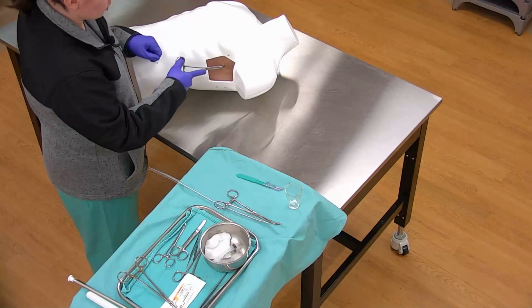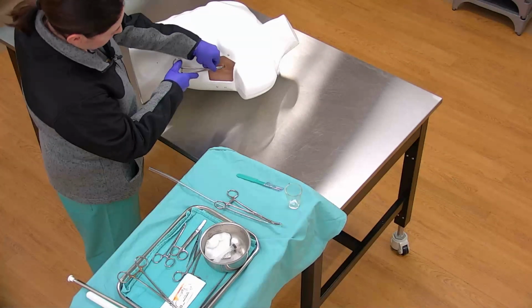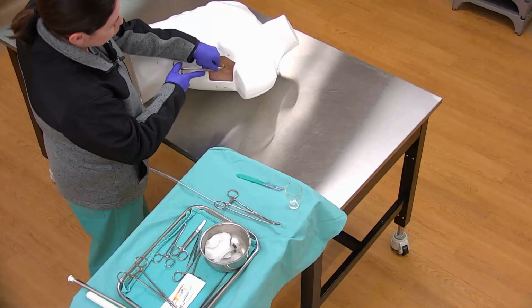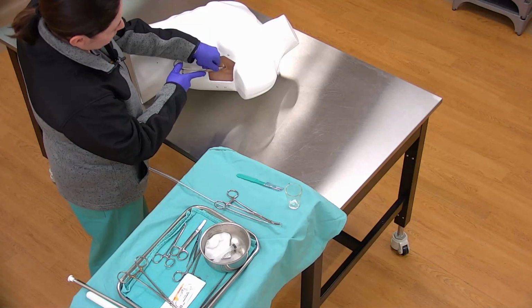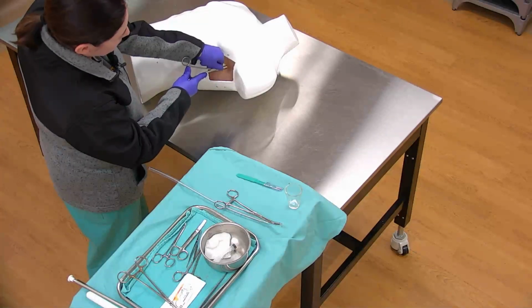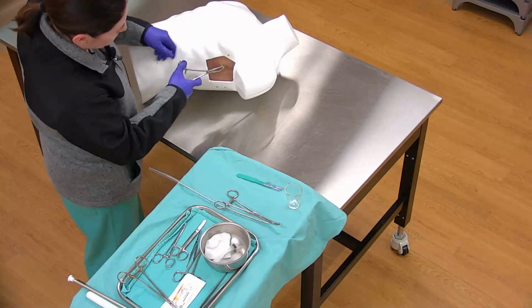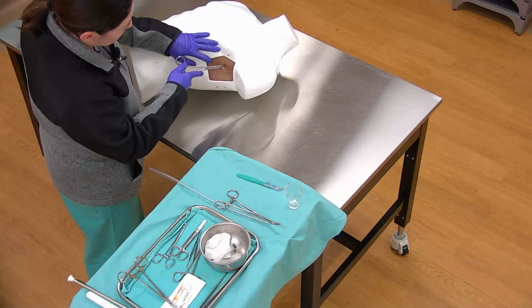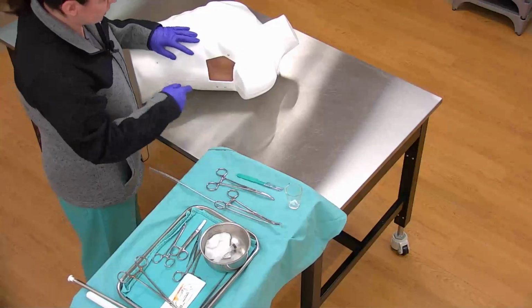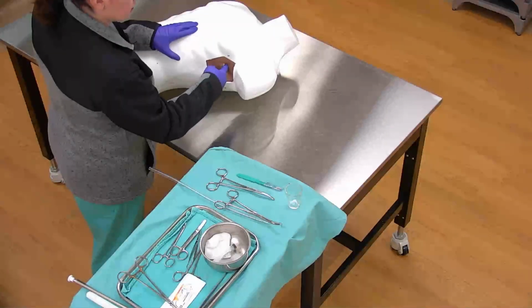When I get close to being in the pleura, I use my second hand as a stop guard. So when I press into the pleura, I'm not accidentally poking in too far and injuring the heart or the lung. A lot of times you will feel a gush of air as you do so. Then continue to spread with your clamp to make a tract for your tube to be placed. I personally like to insert a finger to just confirm that I am into the pleural space.